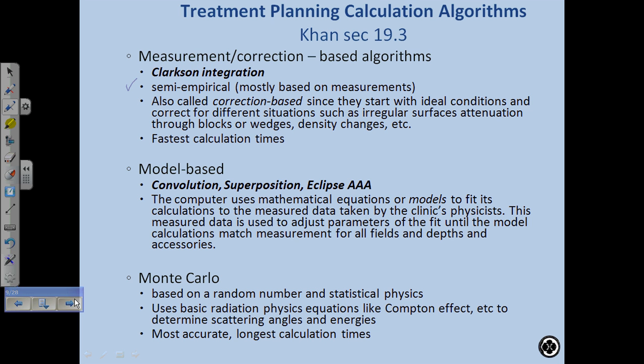The other thing too is the profile that you enter will look like that. Now, what it does, it doesn't take all the data in this profile. It takes this central data, but then out here, these curves, it models with a Gaussian type correction. So it says, well, the beam intensity in the middle is this, and it changes a little because of the horns, you remember the horns? So it uses that central data that you measured, but then the toe and the shoulder, it's going to model with a Gaussian type curve. Okay, so it does some modeling too.